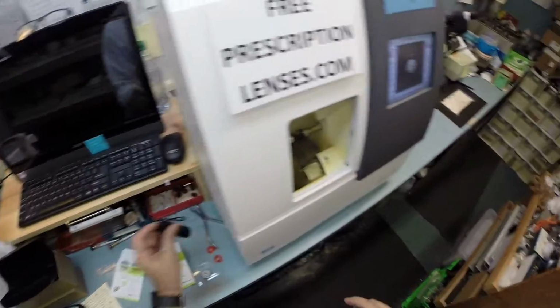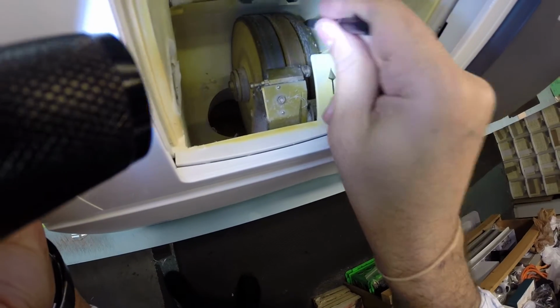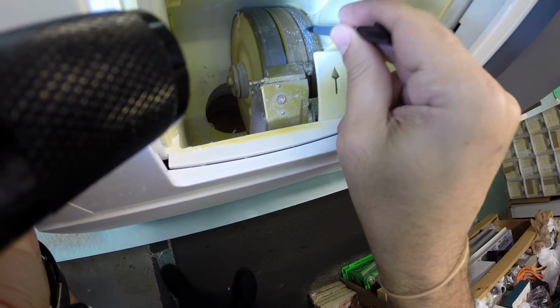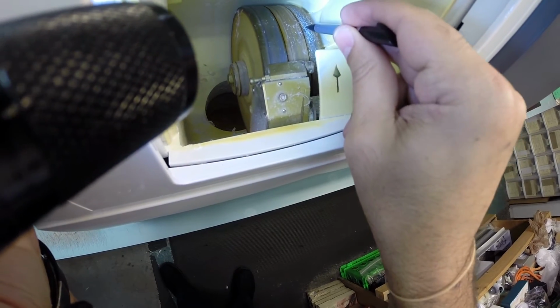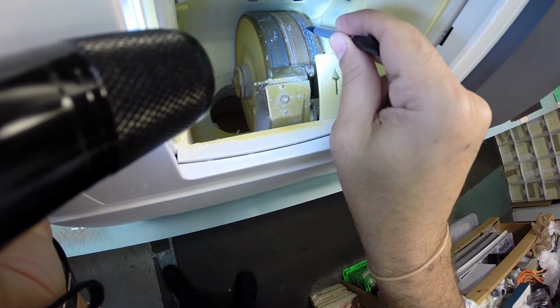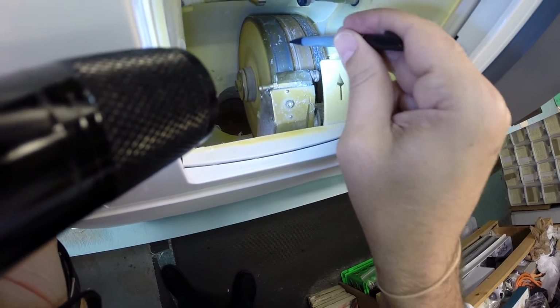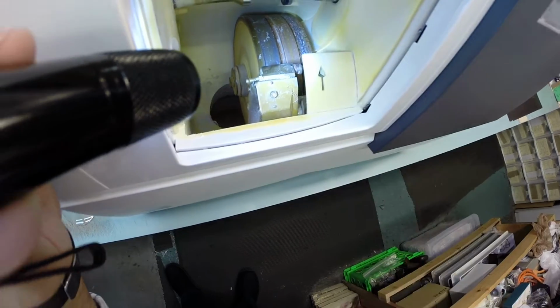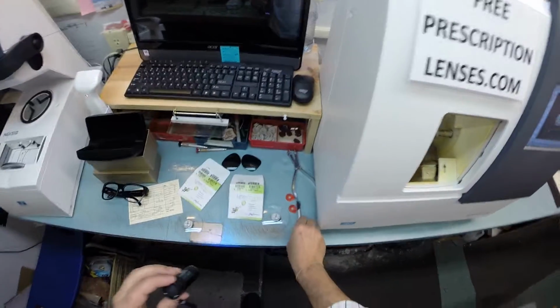So the actual cutting wheel is over here. It's on the right-hand side. It'll move to the center once it begins cutting. This wheel is the cutting wheel. It's going to act like a heavy grit sandpaper to grind away your lens material until it's the final size. This wheel in the center of that channel, that little valley, is what's going to put the bevel onto the lens so it stays inside the bevel of the frame.